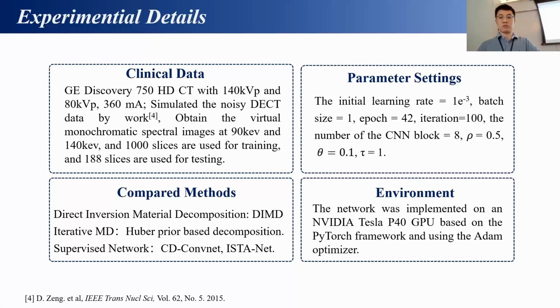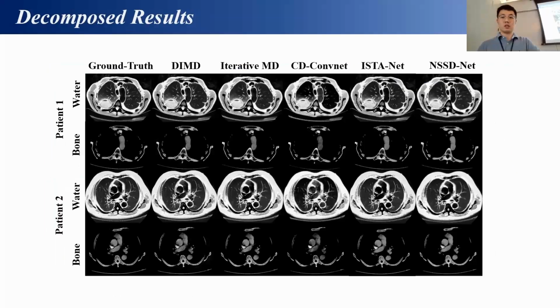So let me show some results of this proposed study. And here are the two material decomposition results of this study. It can be observed that the proposed method could produce high quality basis images and also preserve the structure information with the proposed NSSD net here.